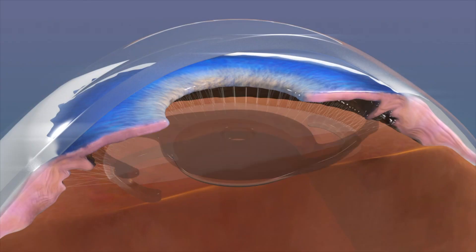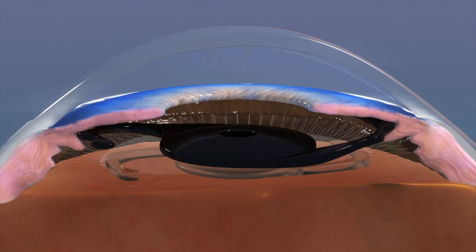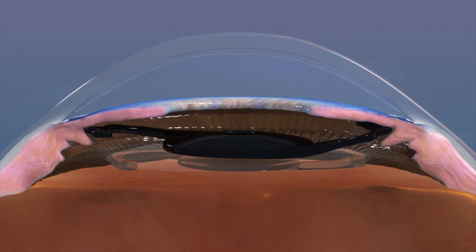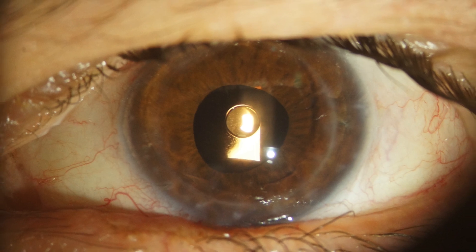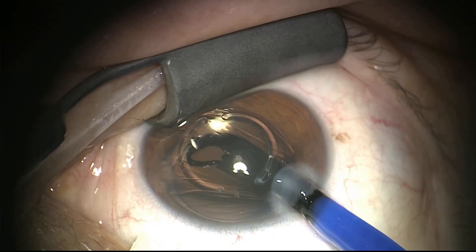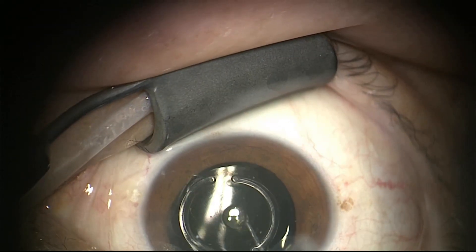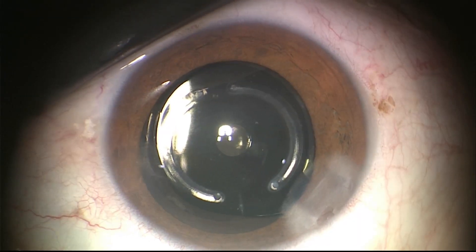The device is made of a foldable black hydrophobic acrylic and is intended for sulcus implantation in pseudophakic eyes in a piggyback configuration. Main indications are post-RK, post-PK, and keratoconus. In those cases, the pinhole effect can be a true hero.